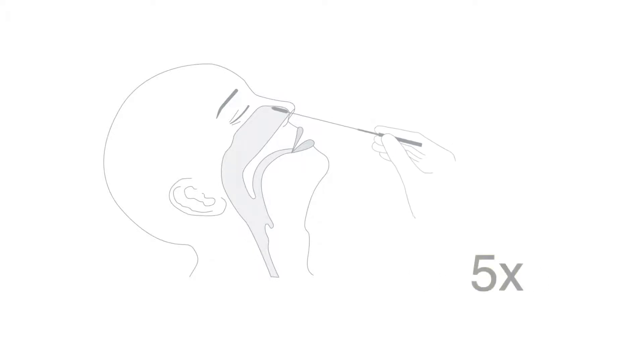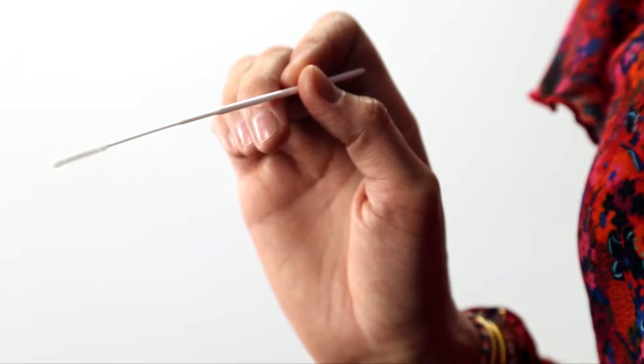Rotate the swab at least five times, pressing it gently against the nasal wall. This will ensure that you collect both mucus and cells. Slowly withdraw the swab from the nose while continuing to rotate it. In order to collect enough specimen, repeat this process in the other nostril using the same swab.